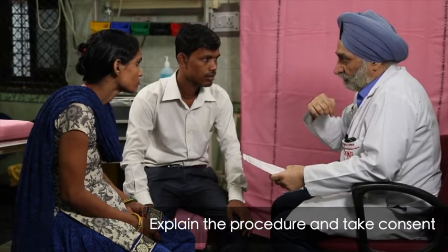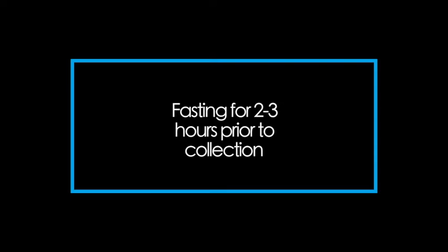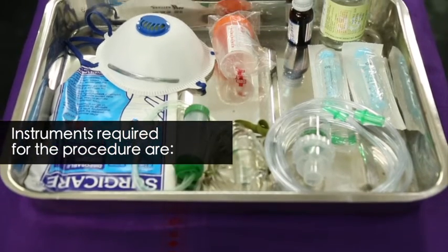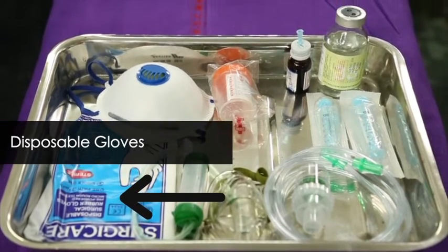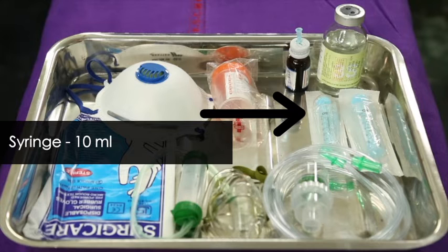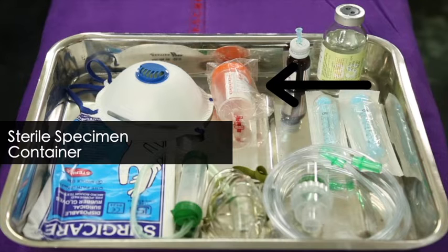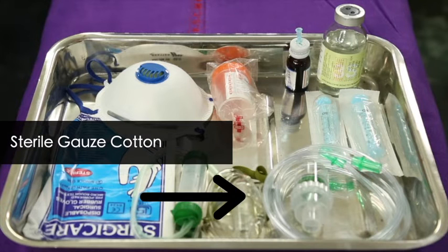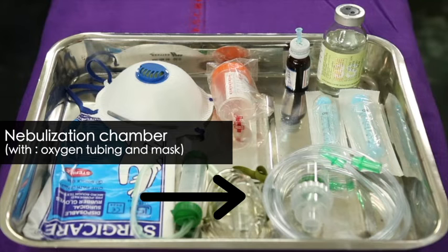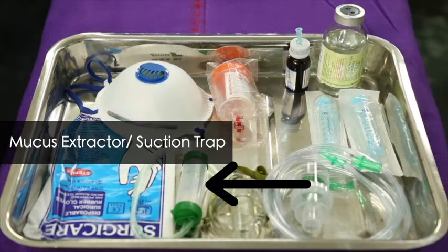Explain the procedure and take consent from the parent or guardian. The patient should be fasting for 2 to 3 hours prior to the collection procedure. Instruments required for the procedure are disposable gloves, hypertonic 3% saline, syringe 10 ml size, needle, adhesive tape, sterile specimen container, sterile gauze, cotton, nebulization chamber with oxygen tubing and mask, salbutamol, and mucus extractor or suction trap.